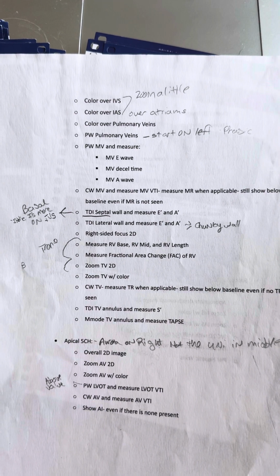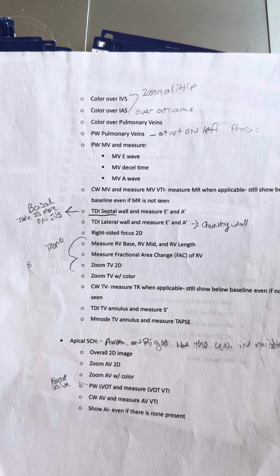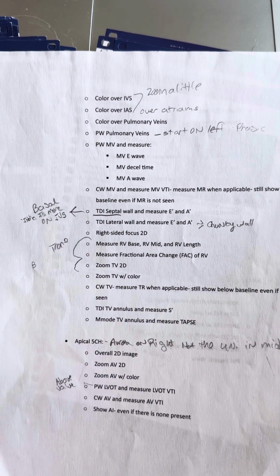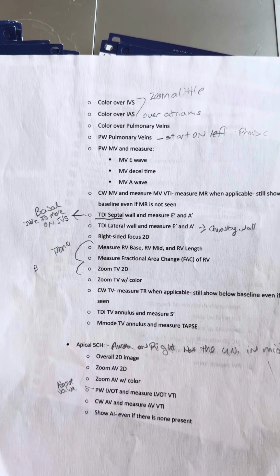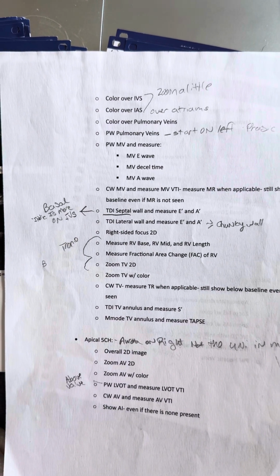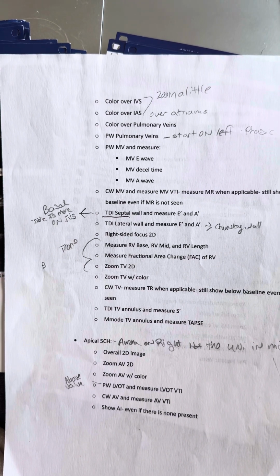You will then TDI your tricuspid annulus and measure S prime. M mode tricuspid valve annulus and measure TAPSE.